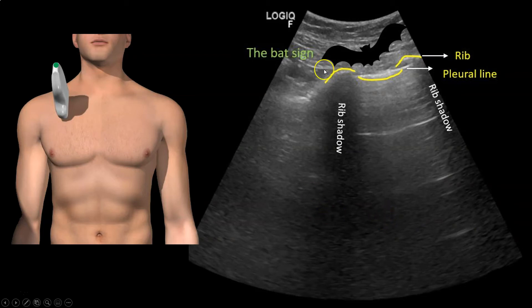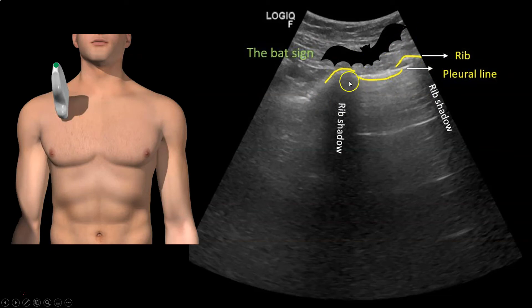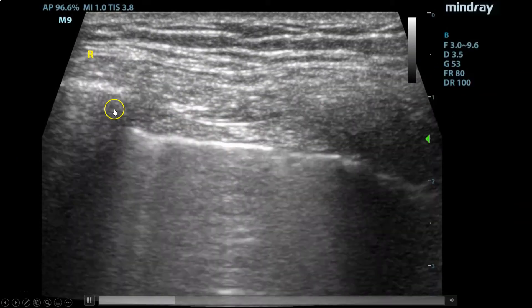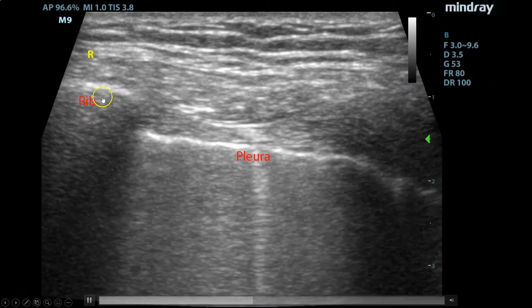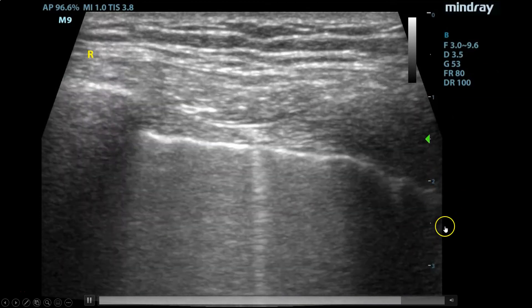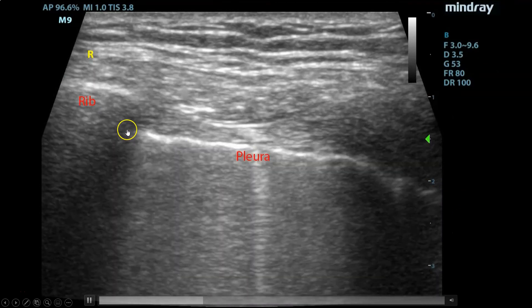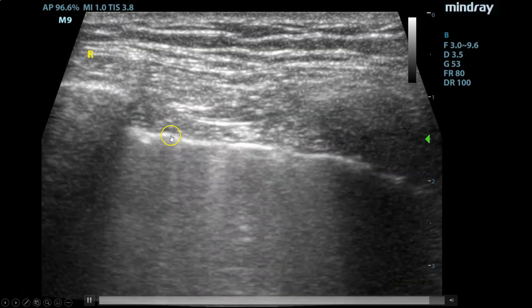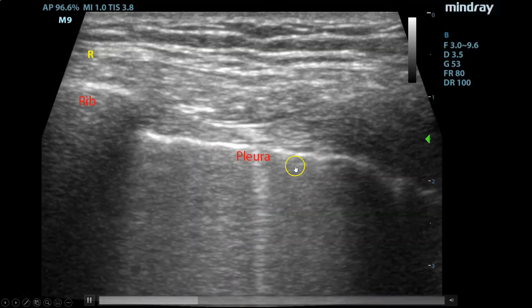This exact view of seeing rib, rib, and pleural line is called the bat sign. In real life, you'll see there's a rib there, barely visible at the bottom of the screen, and then this is the pleural line shimmering back and forth — that's lung sliding.